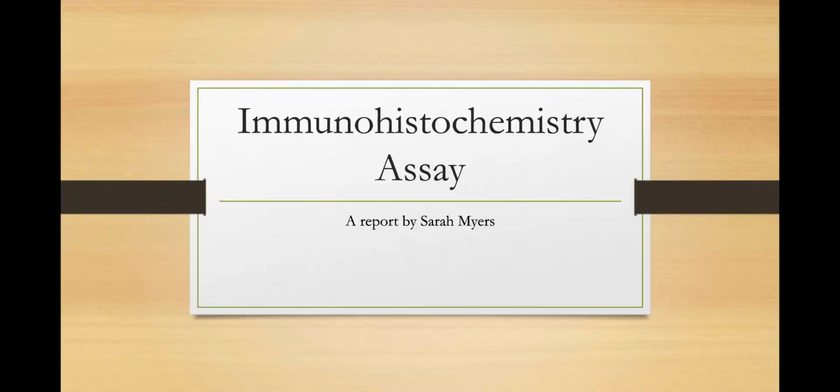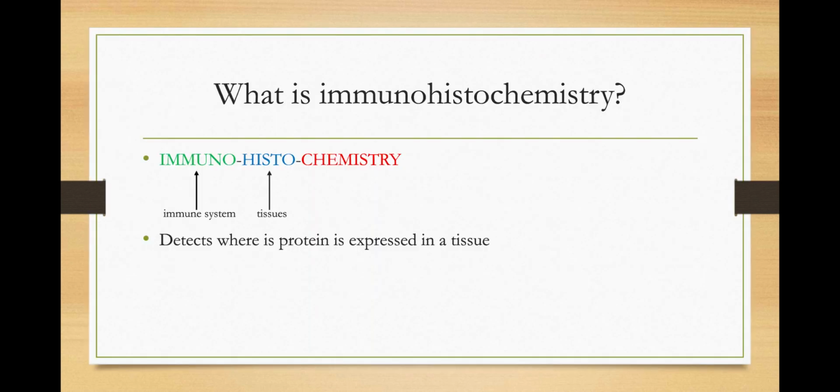Hello. Today I'll be discussing immunohistochemistry, which is a molecular process and technique with many beneficial uses that will be outlined in this presentation. Before beginning, it is important to understand the word immunohistochemistry.